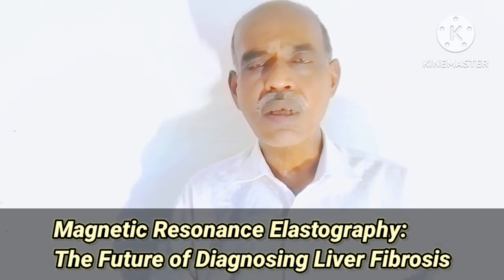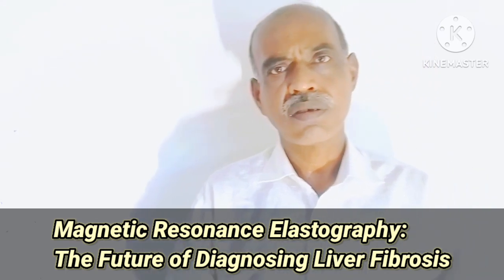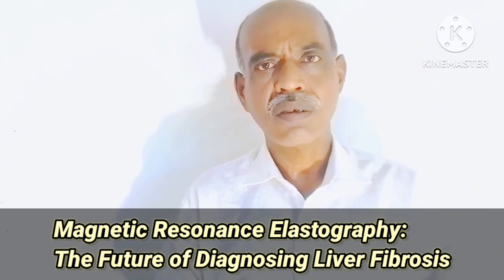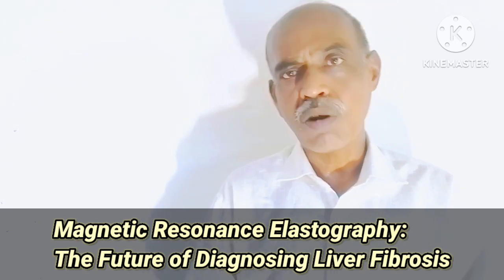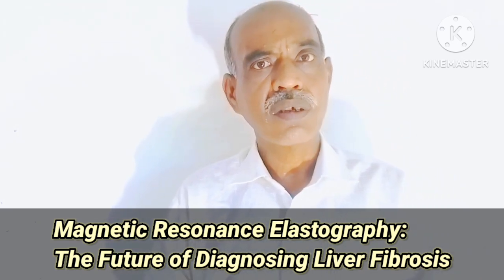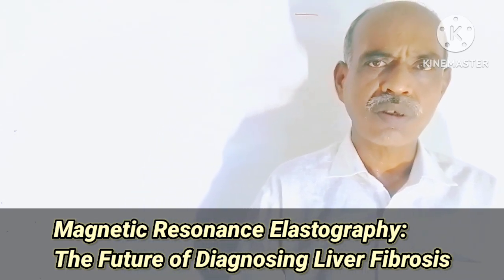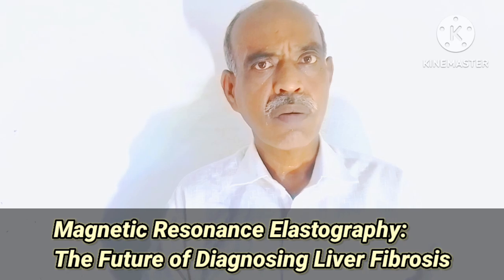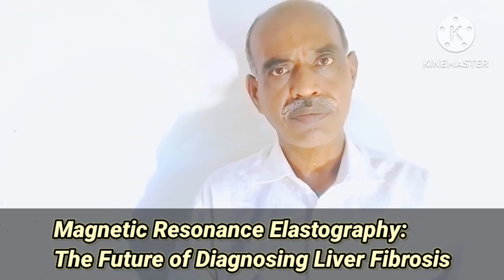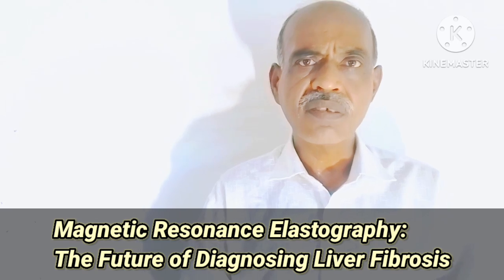But the problem with MRI is that MRI cannot measure the stiffness of anything, whether it is liver or anything. So here in this technology, that is MRE, magnetic resonance elastography, both are combined together. And the combined effect gives us the desired result.